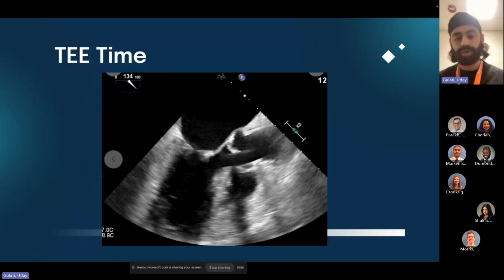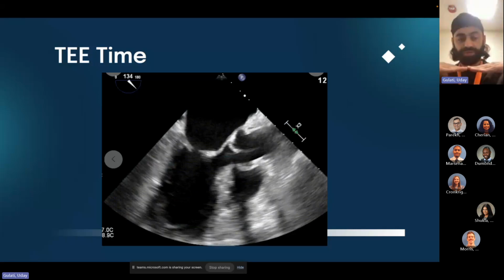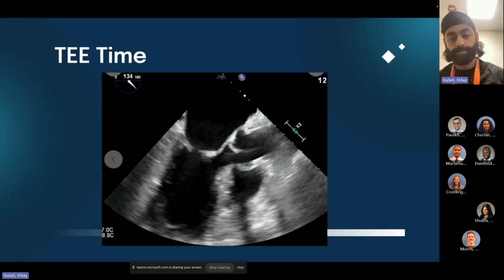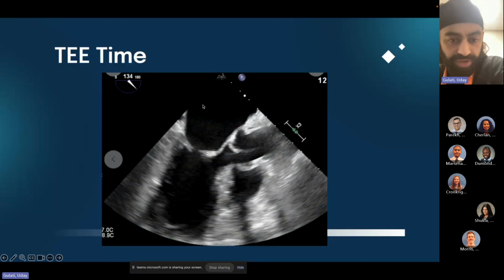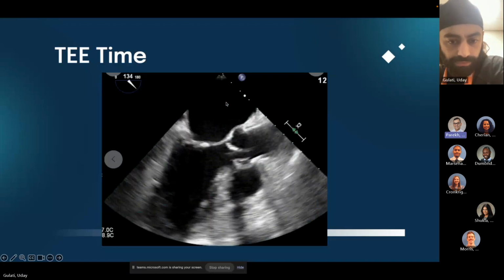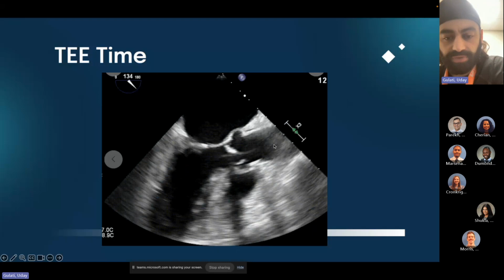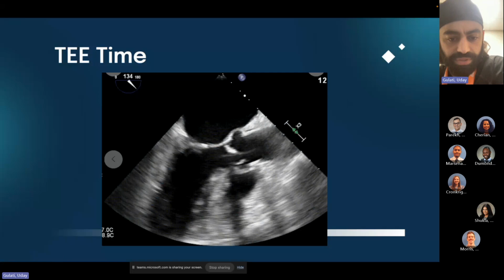And so the way you get the parasternal long, right? You talked about that beam rotation, and what you're doing with that beam rotation is turning it past 90 degrees and then a little more into 130 degrees, so you get that view. And so what you're seeing here, what structures do you think is over here? Left atrium, right? Yep, absolutely. So this is your mitral valve, this is your left ventricle, this is your left ventricular outflow tract. Cool. Pretty straightforward, overall normal function, no real issues.